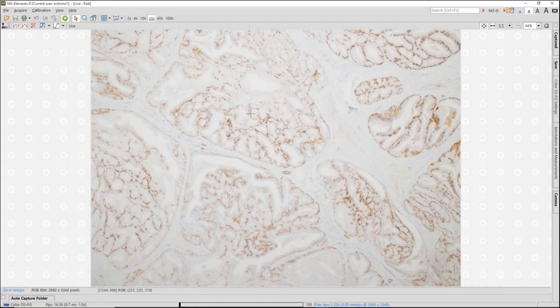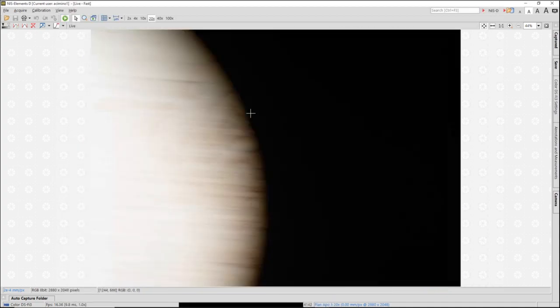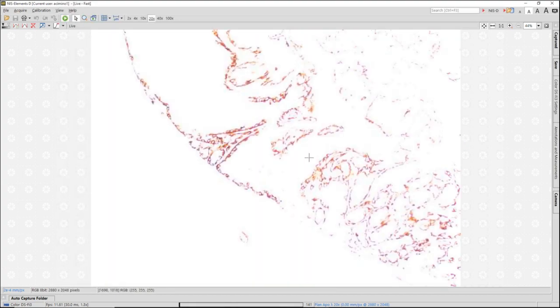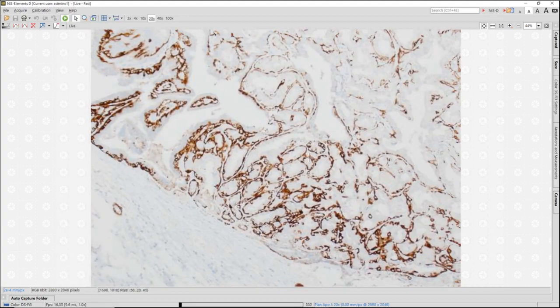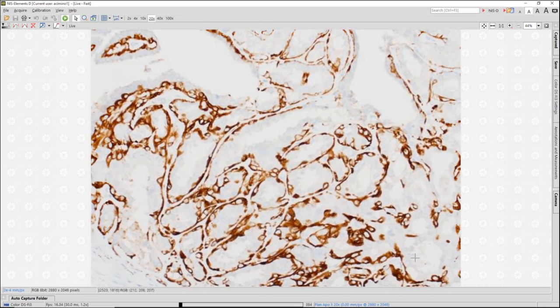First we'll back out and look at the architecture. If I look at the overall architecture of this lesion, I notice that I have my myoepithelial cells intact at the periphery and intact within the fibrovascular cores. This is a smooth muscle myosin heavy chain cytoplasmic marker for myoepithelial cells. I see that I still have intact myoepithelial cells. The underlying architecture has to be of an underlying intraductal papilloma because that's the only one that still has the myoepithelial cells in the cores.